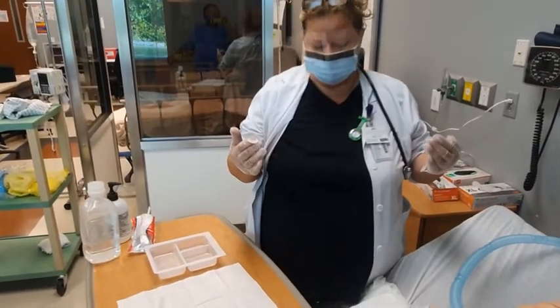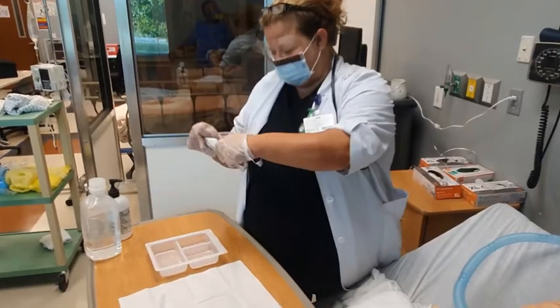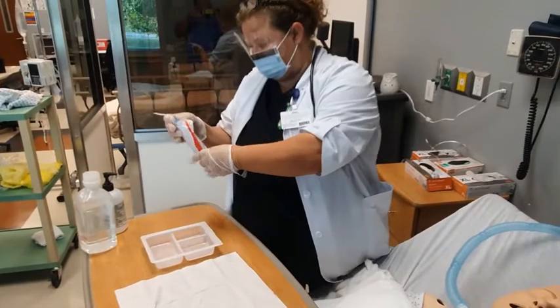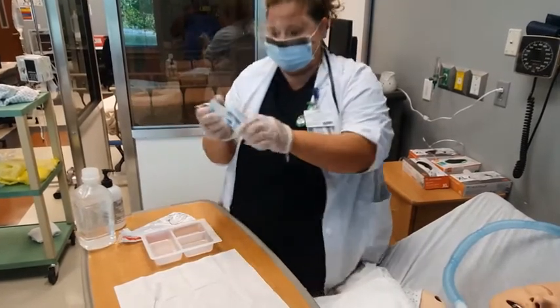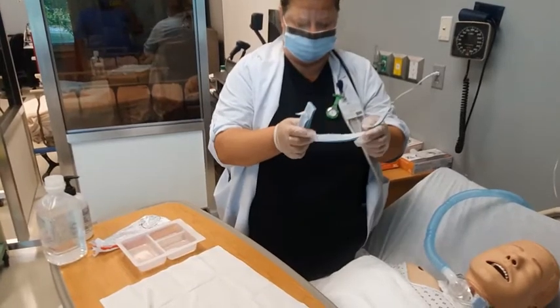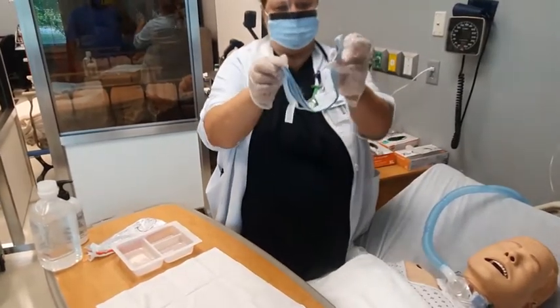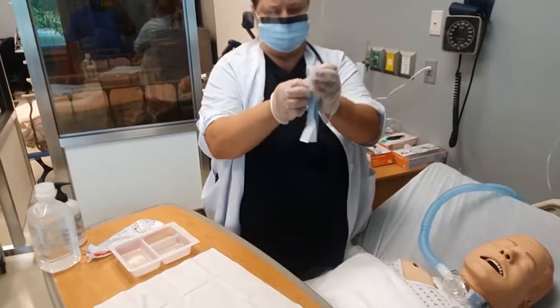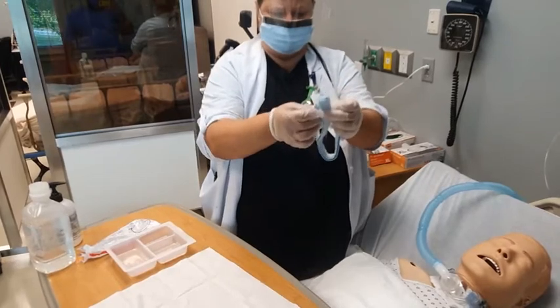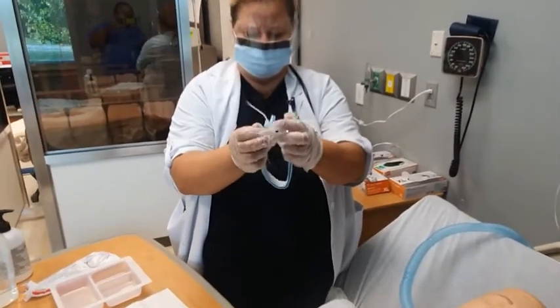Tracheostomy holder, always leaving the old tie in place until the new holder is secured, unless, of course, you have an assistant. Be careful not to ever cut the cuff tubing if trach ties are used. So this is the holder. It will come open. You just make sure that you have the little ends sticking up on both sides. It is a Velcro. If the patient's neck is a little bit bigger, it does adjust back here so you can actually make it longer.